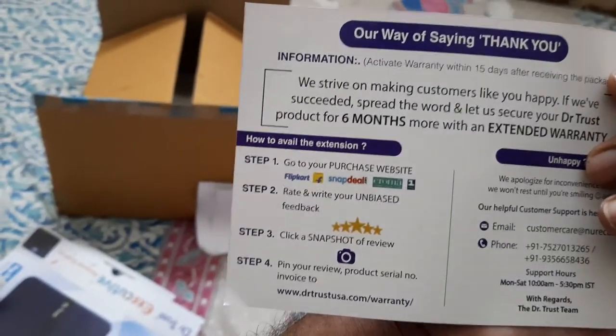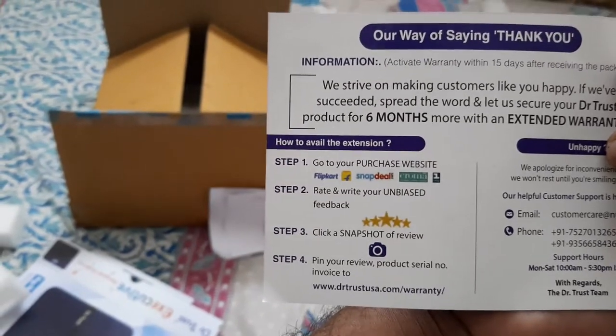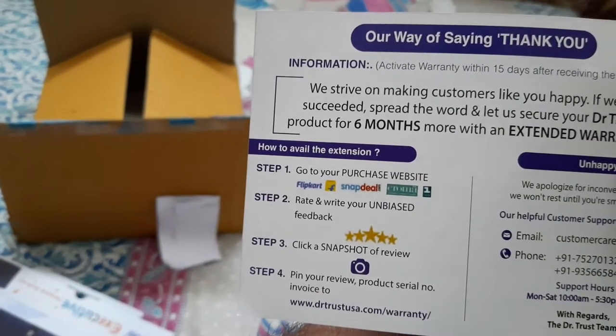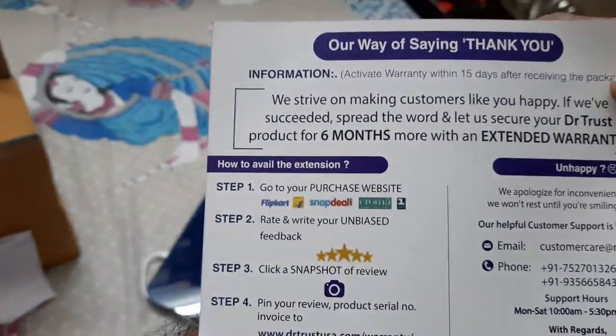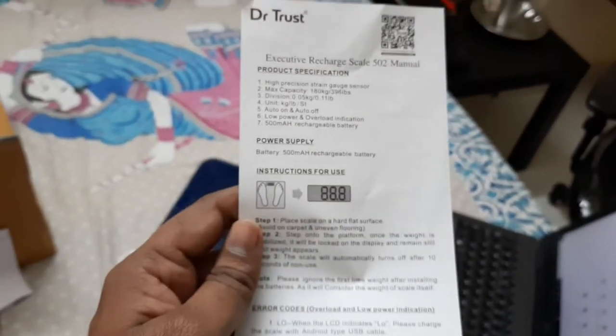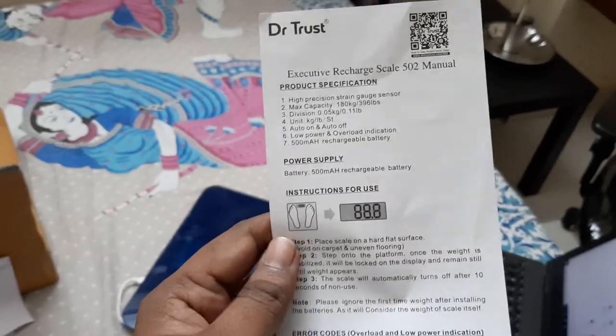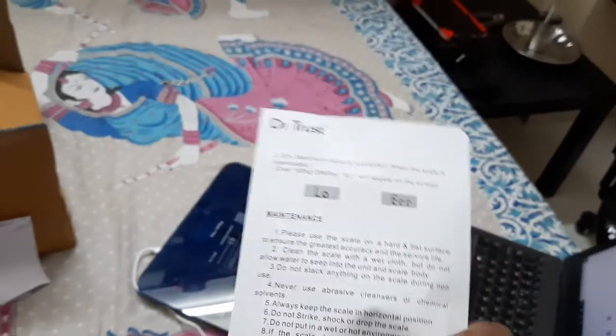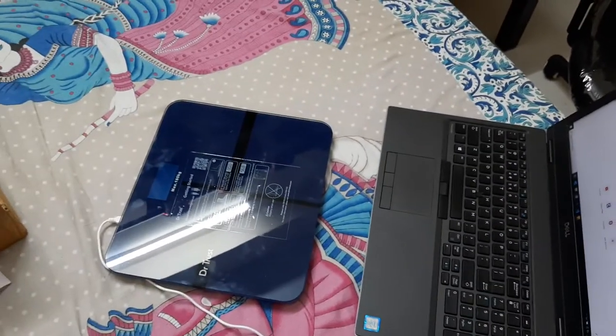I need to give an unbiased review and also register this product with the serial number on the DrTrustSA.com website, which will extend my warranty for another six months. There is also a manual and it has a 500 mAh rechargeable battery.